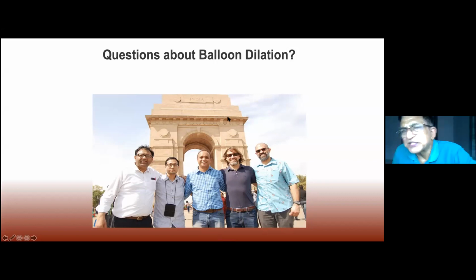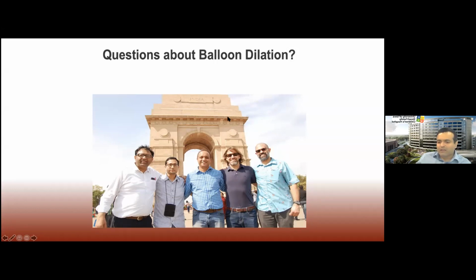So what happens if there's a cricoid fracture? Yeah, if you are using anything more than a 2.6 millimeter size bigger than what the age-appropriate airway is, you'll end up producing a cricoid fracture. But that was done in animals. But that just gives you a little bit of an idea of how important the sizing of the balloons is.